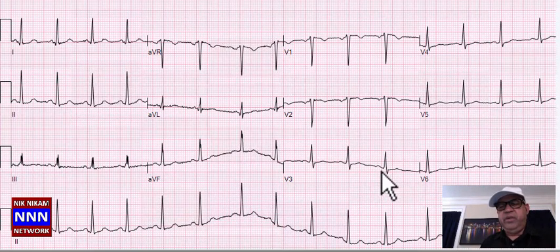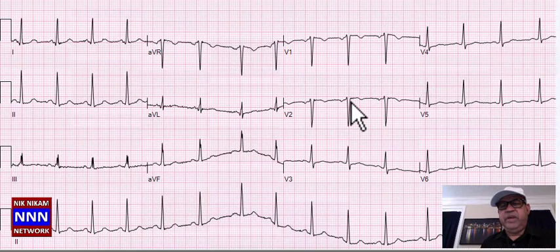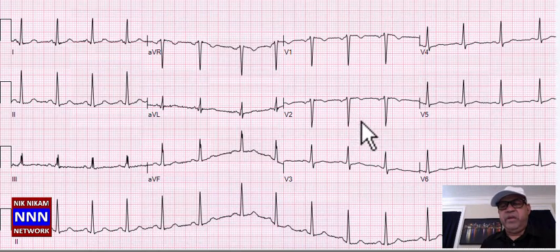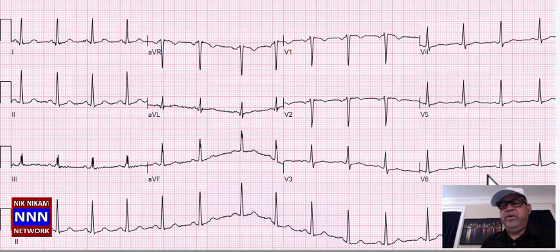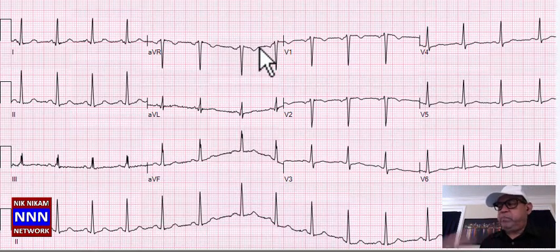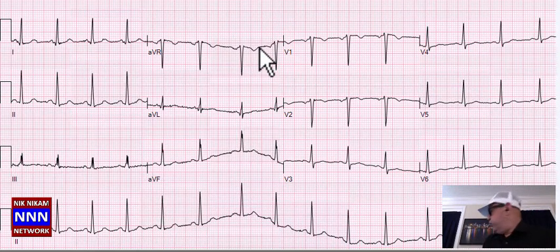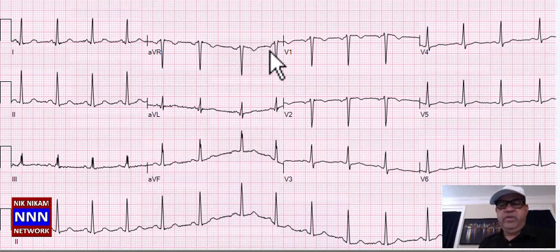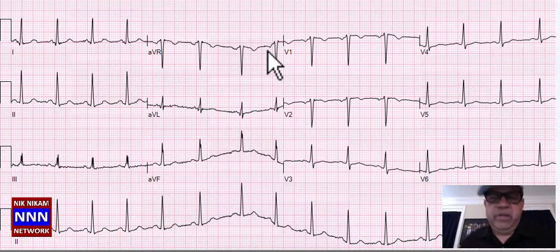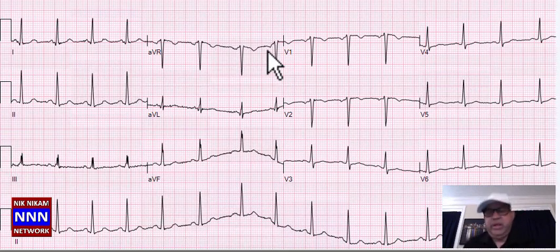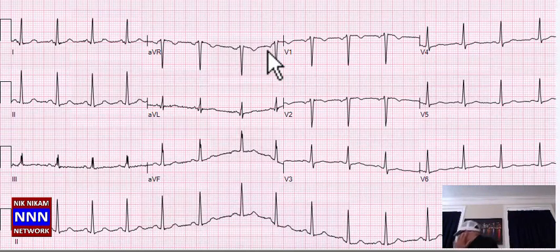Here we have sinus rhythm again with T-wave changes. Anteriorly we have loss of R-waves — this patient could have had an old anteroseptal myocardial infarction. Again we have diffuse T-wave changes with possible loss of R-waves anteriorly.